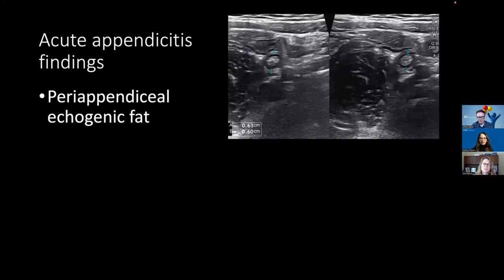With our cines, the techs don't always know they see the ileocecal valve and cecum, but on the cines, you can tell that that's what it is. So whether or not our techs know they're looking at it, they're finding it for us usually. I agree. Yeah, I do feel like you pick up so much more on the cines, especially if you know what you're looking for. And hopefully, with all these lectures and talks, more and more people will have the same eye for those findings.